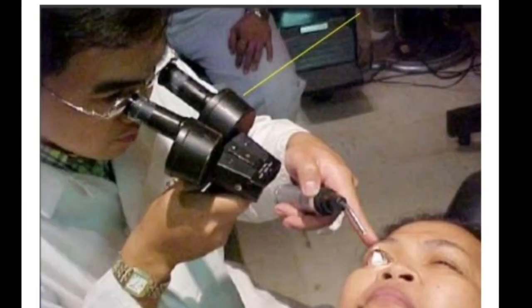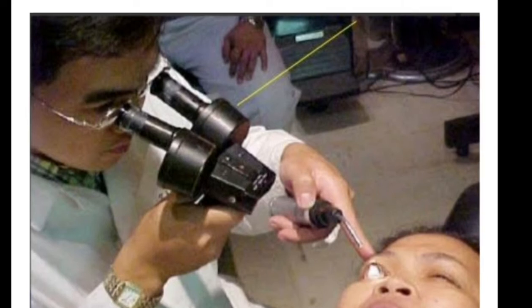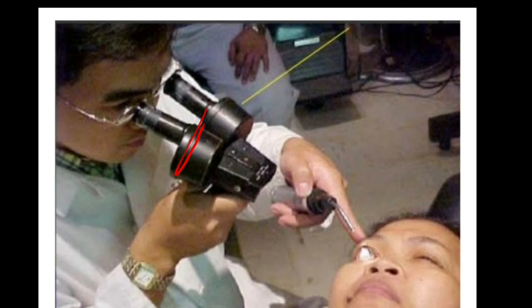Okay. So what is the procedure of direct gonioscopy? After making the patient lie down in the supine position and anesthetizing the cornea with topical anesthesia, the goniolens is placed over the cornea using balanced salt solution or viscoelastic material. And then the examiner holds the biomicroscope in the hand. Okay, in one hand he will be holding the biomicroscope, and in the other hand the light source, and in some of the biomicroscopes the light source comes along with it, then the other hand will be free for manipulations. Okay, and then he visualizes the angle structures. Whichever quadrant the examiner is concentrating on, the same quadrant's angle structures he is visualizing in the direct gonioscope.